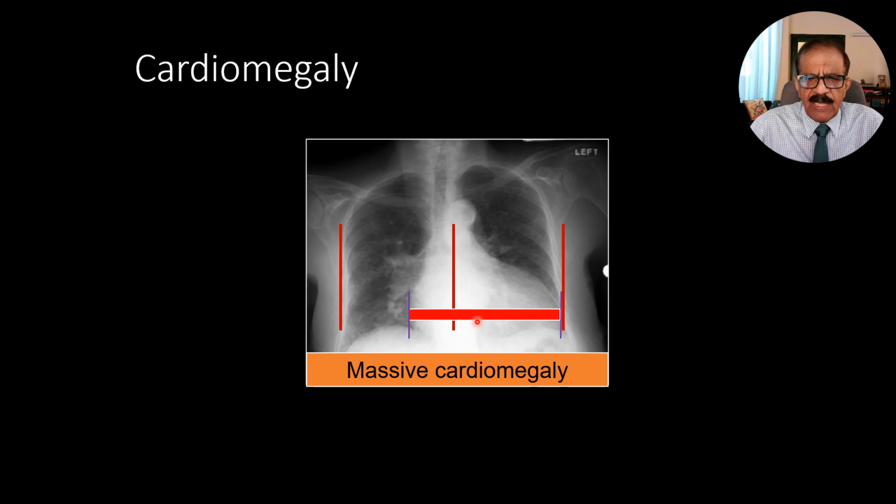At one point, it is perfectly possible to have a fairly advanced disease with normal heart size. And it is also possible to have somewhat cardiomegaly due to non-cardiac condition, and that may be called pseudocardiomegaly, and the heart may be normal. So you need to be watchful. Cardiac enlargement is one of the features of the heart diseases.